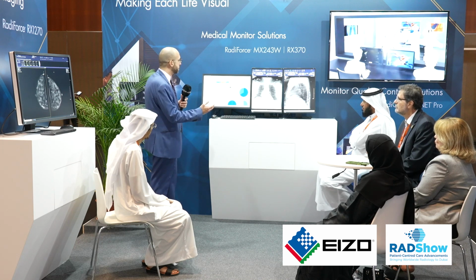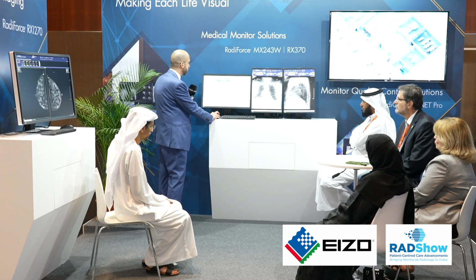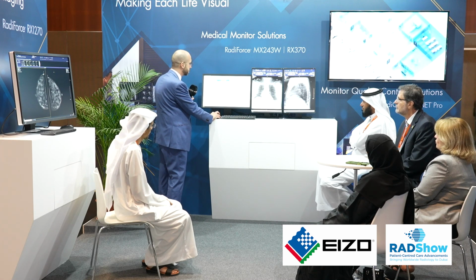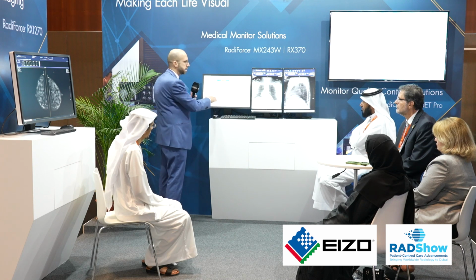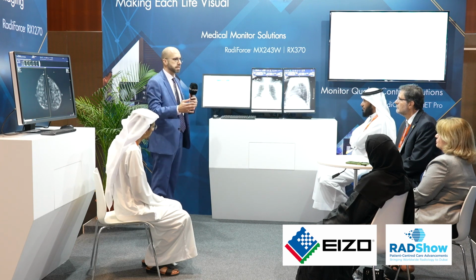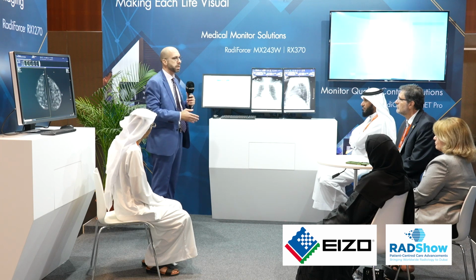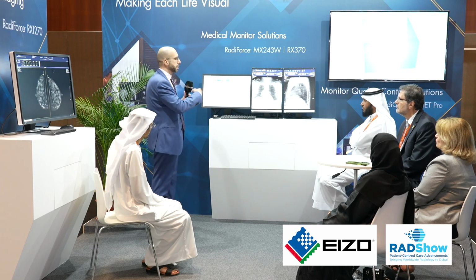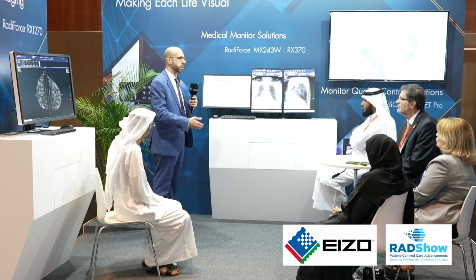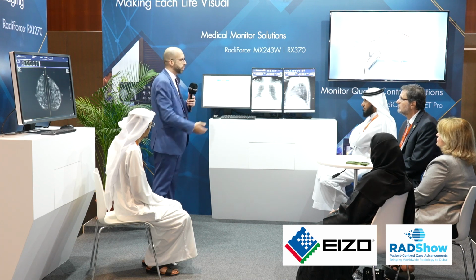On top of this, you can set the schedule for the calibration for the monitors, which is very important. Here you see the list, so you can select and set the schedule. Let's say you want this monitor in this department to be calibrated at this specific time. It will automatically calibrate when it's idle, so it will not stop the user when he's working.